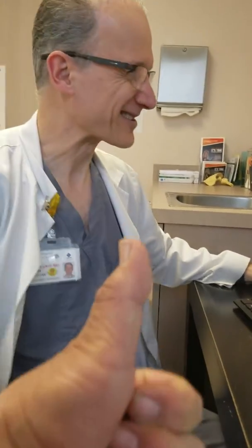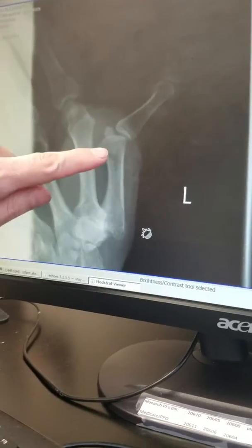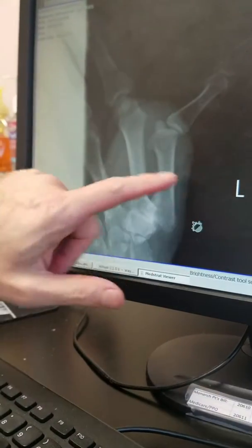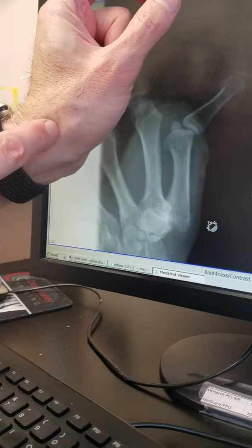Look at it good? Yes, there we are, Doc. So look at this X-ray with your camera. If you look at this X-ray, you see this is a joint that you're hyperextending, which is this joint right here. So the joint below it is called the CMC joint. That's this joint right here on the X-ray.